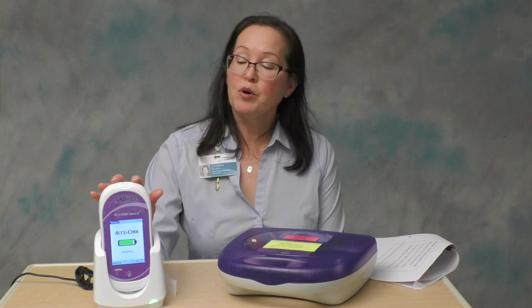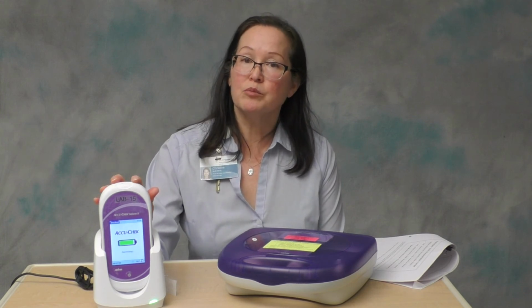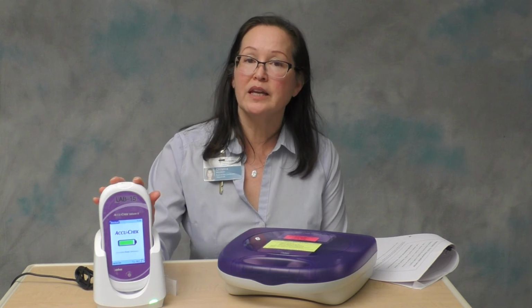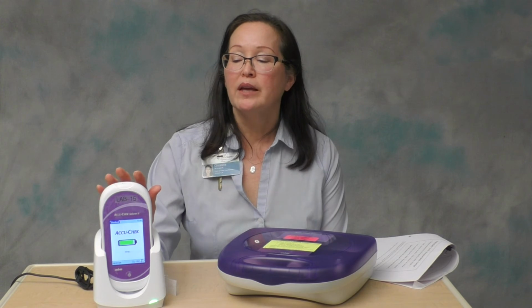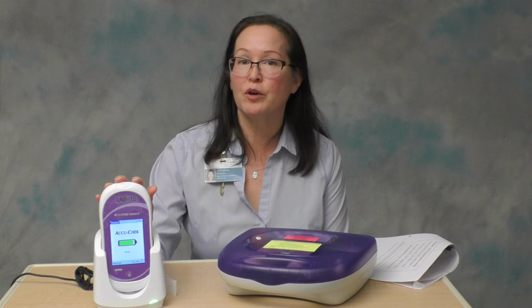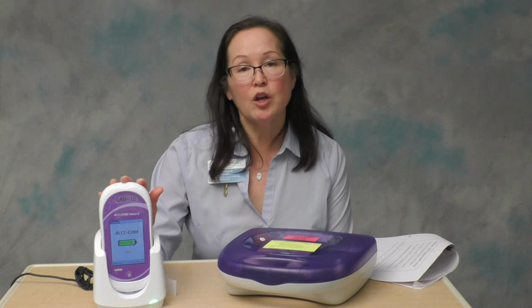Again, a reminder, the reportable range is 10 to 600 milligrams per deciliter. So if you get a low as a result, that indicates your patient's blood sugar is less than 10. Repeat it on the meter. If you still get a low, then you're going to treat that patient right away. If you get a high, that indicates the glucose is greater than 600 milligrams per deciliter. Repeat it on the meter.